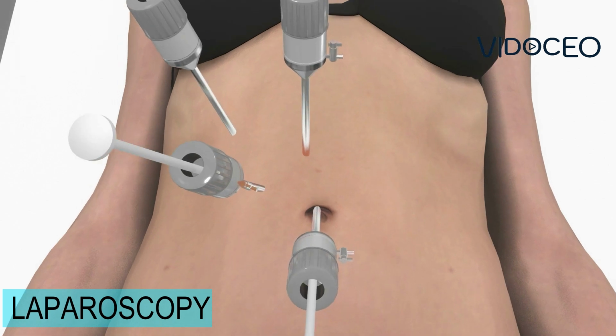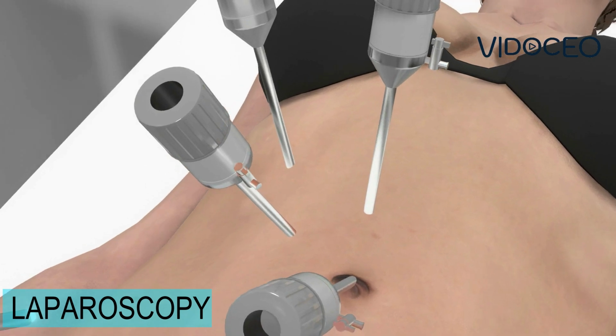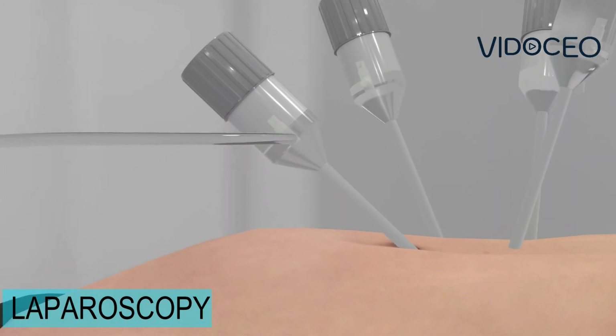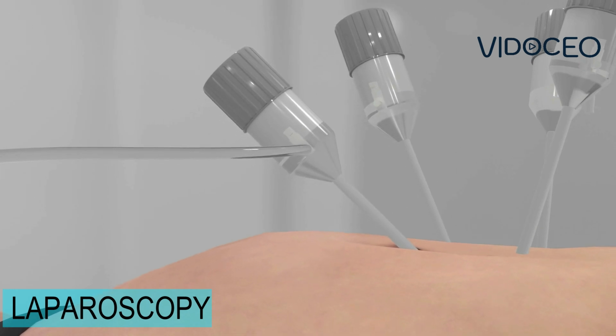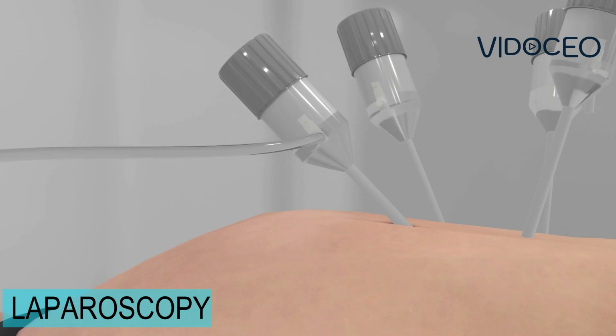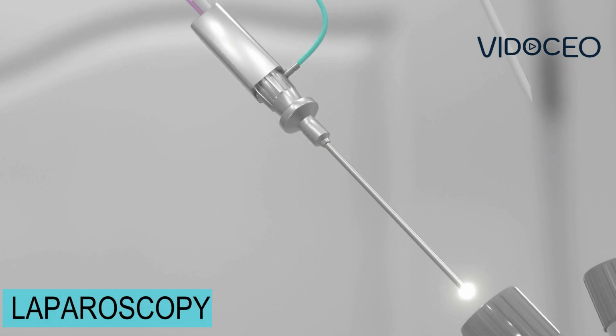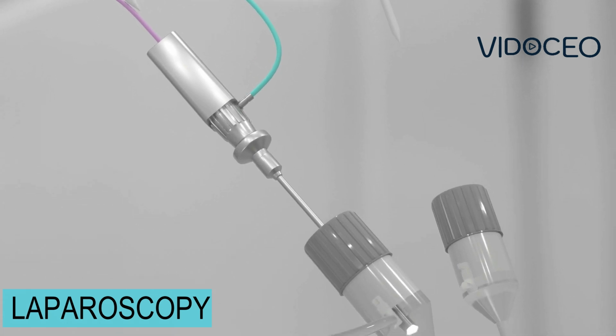The abdominal space is inflated with air to allow space to work, and long, skinny instruments, along with a tiny camera, are inserted to visualize the internal structures. The surgery is performed using the laparoscopic instruments controlled by the surgeon, but the surgeon does not need to place their hands into the abdomen.